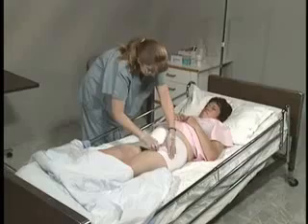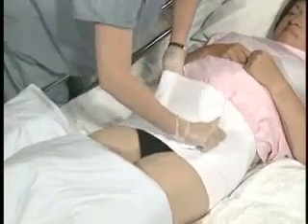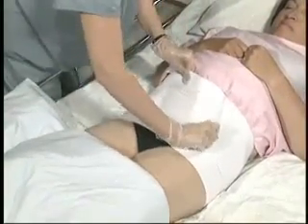To adjust the fit, simply peel the surfaces apart and reposition them. The closure can be diagonally angled to conform to any patient's body shape. It's important to correctly and adequately stretch the binder. Remember, it won't restrict breathing. To the contrary, it's the stretching and compression which facilitates deep breathing.